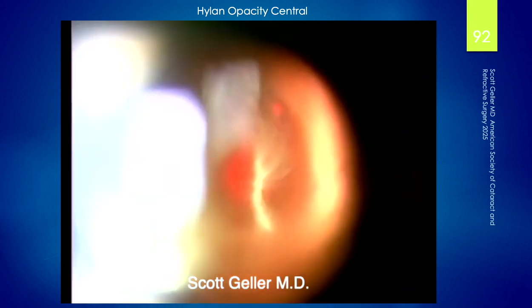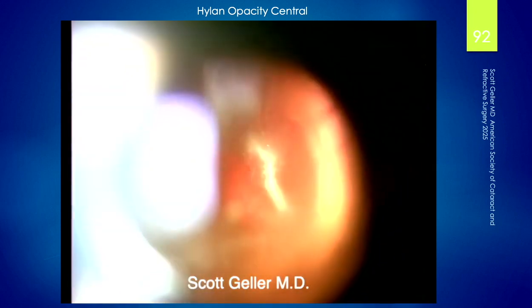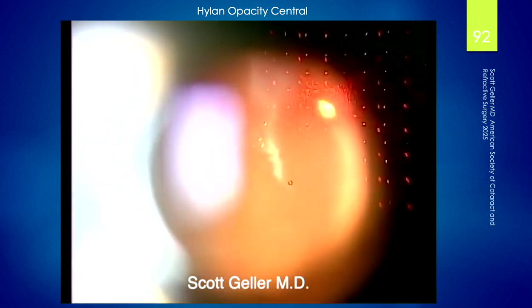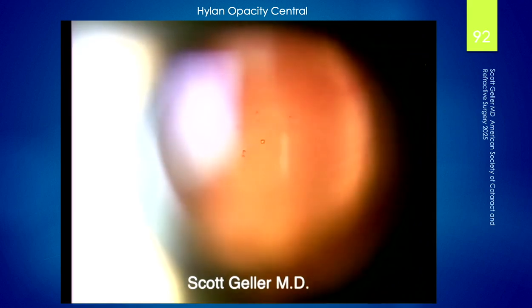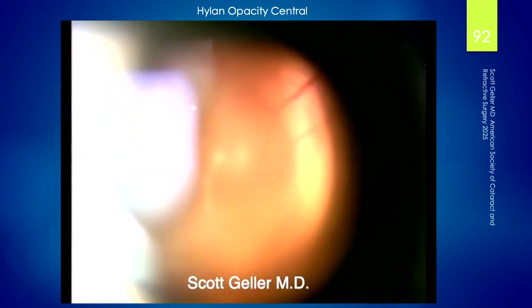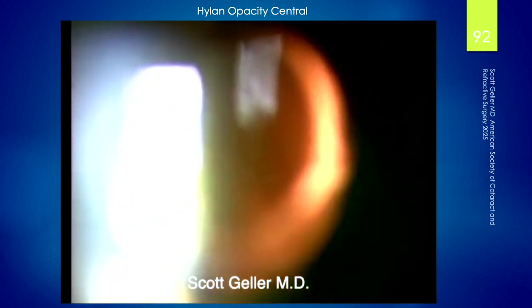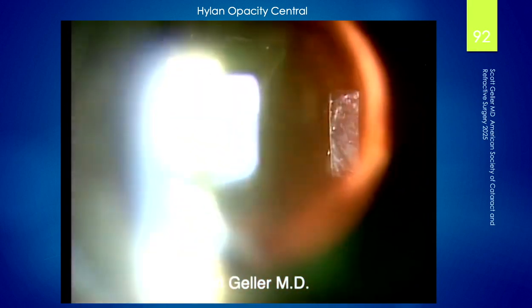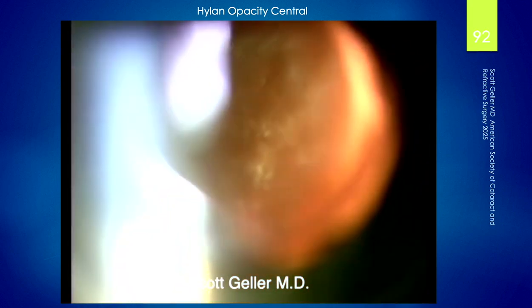The surprising part about this is when I initially saw this patient, I looked at it and said, oh, well, this is an easy deal. And then when I got the patient in front of the laser, because I initially examined them with my slit lamp and the Goldmann lens, I saw this other opacity.